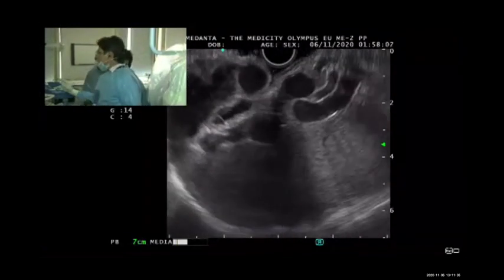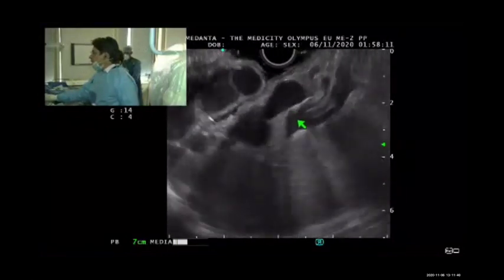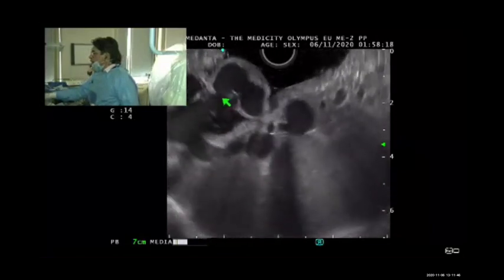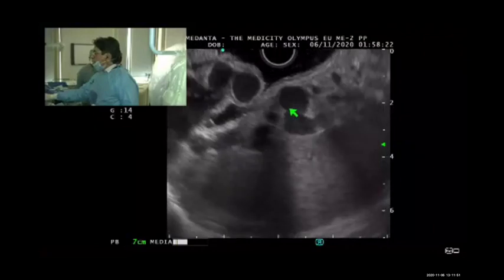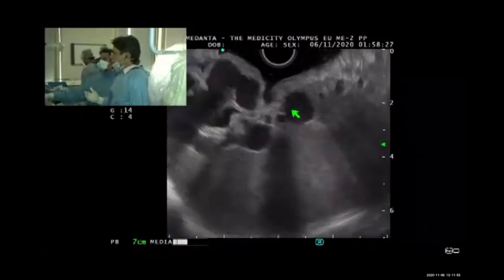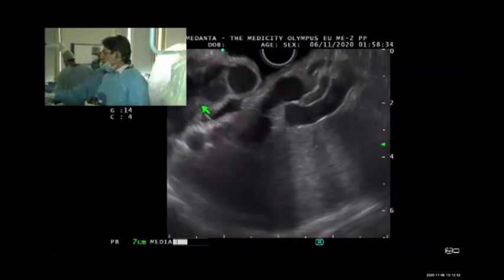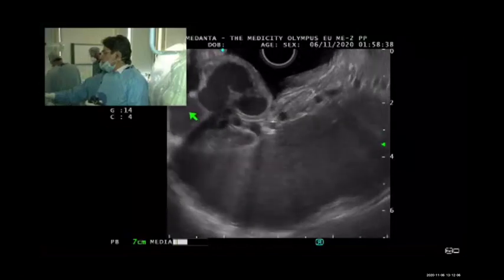Now you look at here. These are the large collaterals. Can you see this is the large collateral which is outside the gut wall, and this is within the gut wall, in the submucosa. So this is the fundal varix which requires to be injected. This should not be injected, otherwise there is a migration of the coil and patient will end up with embolization. If you look at here, the perforator is very big. Can you see here the perforator is very big? Have you noticed? Yes.